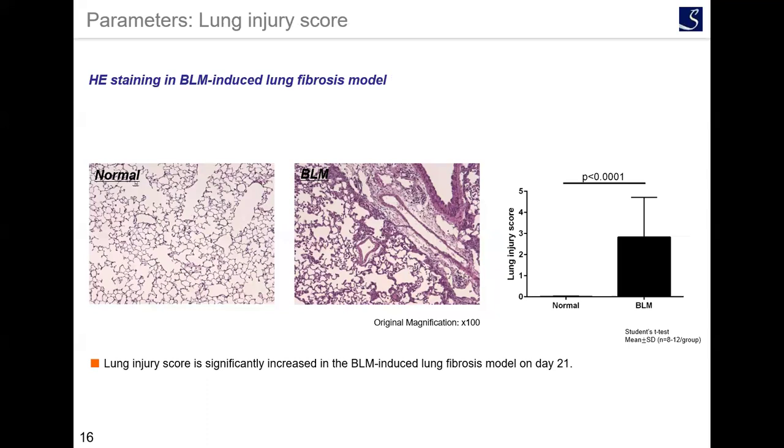And lastly, here is a H&E staining of this model. Lung injury score is increased by 3 to 5-fold compared to normal group. The lung injury score ranges from 0 to 4, respectively, representing no damage, mild damage, moderate damage to severe damage.